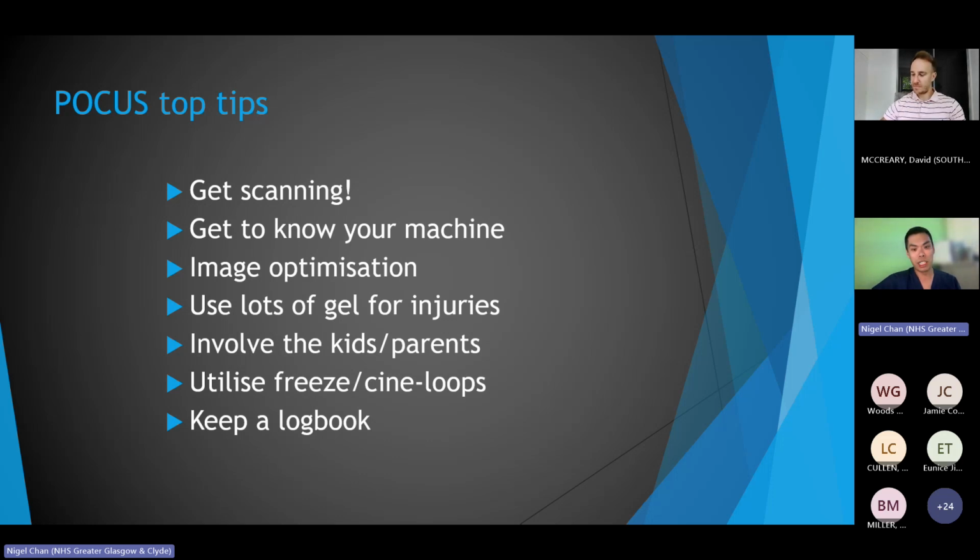And ultimately, as I said, it's not to replace getting a CT or getting a proper radiology scan, but it's just to help me have a bit more information whenever I'm trying to make a decision about what to do with my patients. We're all taught to look, listen, and feel. So whenever we're examining someone, we listen, we feel, but why not also have a look with an ultrasound machine?